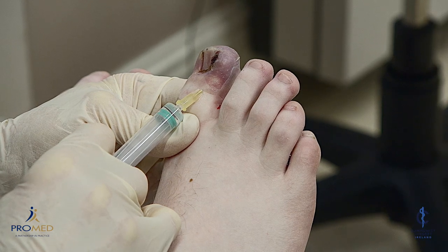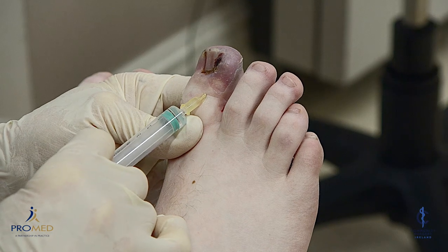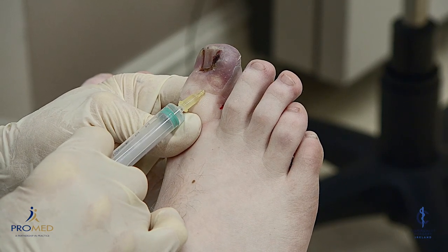A lot of pressure here just to get the local in, but you can see that the skin is going a bit white. That's going to make sure that during the next stage you'll feel absolutely nothing.